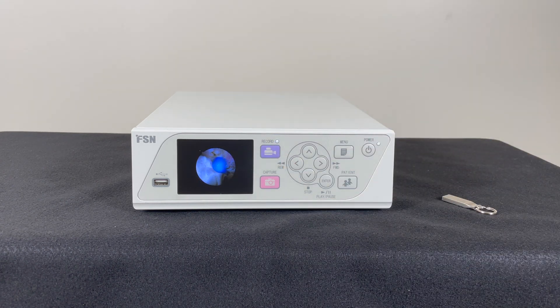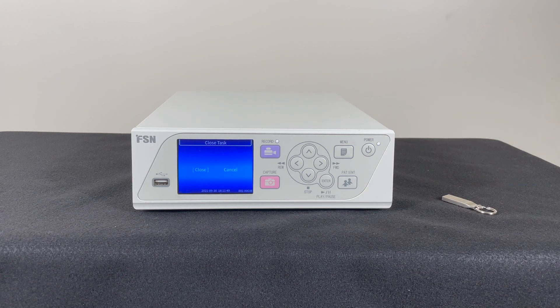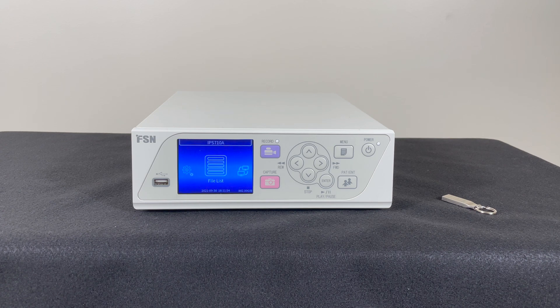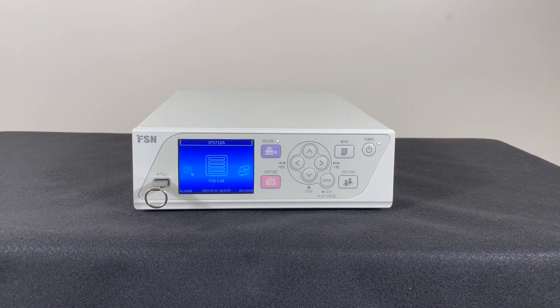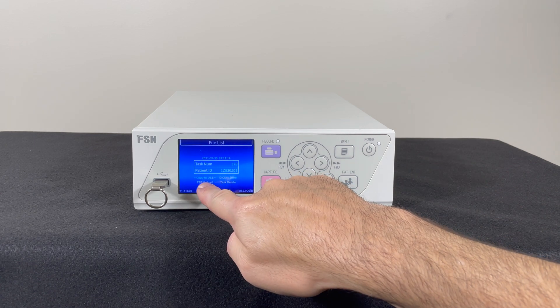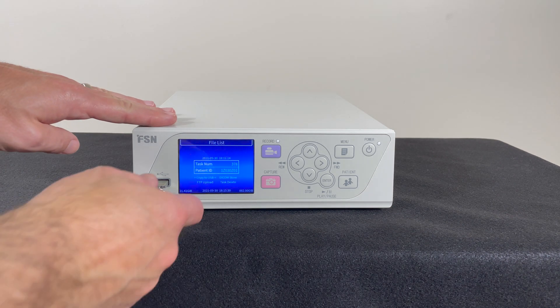Press the record button again to stop the recording. Recording task 387 is now finished. The close button is highlighted — press enter to close the task. To save a task onto a USB stick, place the USB all the way into the slot. Press the menu button, then press enter for the file list. The last recording will be selected. Press the down button to move the cursor to Copy USB and press enter. To choose a past recording, press the left button until the desired task is selected. The files are saved to the USB stick.